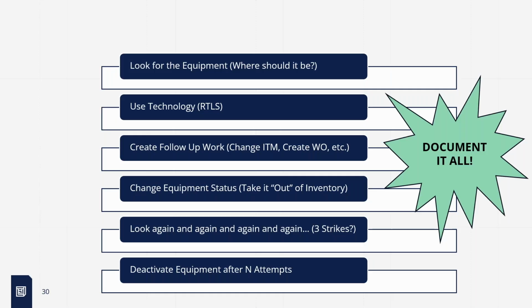A lot of the time, for compliance with Joint Commission or GMP, it's around the device type and what it's used for, and also the manufacturer and model. Even in the old ECs, for medical equipment there was not much variance in where those things fell. On the facility side, there was. If it wasn't marked as an exit light properly, there was a specific EP for exit lights, where the medical equipment didn't really have that granularity, and it's even less now.